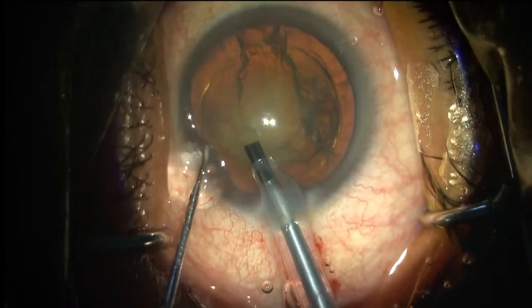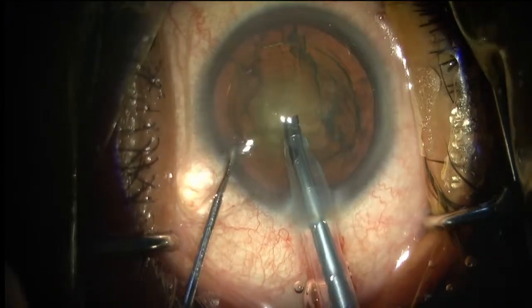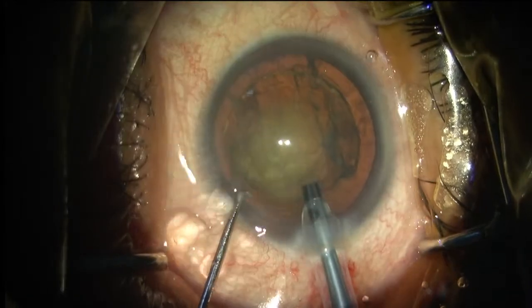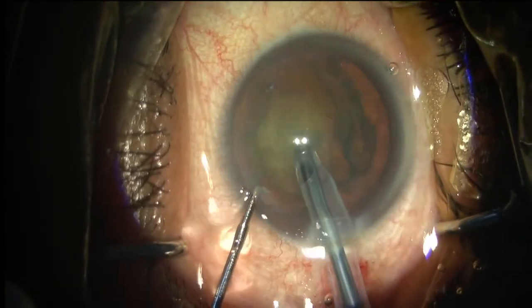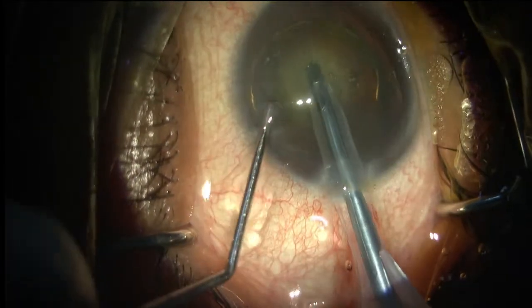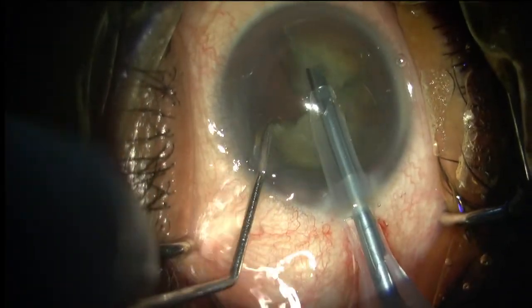And so what I'm doing is I'm removing the epinucleus plate from the anterior surface of the nucleus so that the anterior surface of the nucleus is bare. And my preferred technique is stop and chop. But this nucleus is getting shifted, already lifted, so I can just go and chop it.